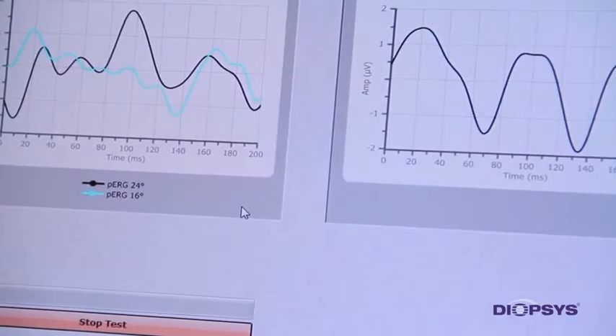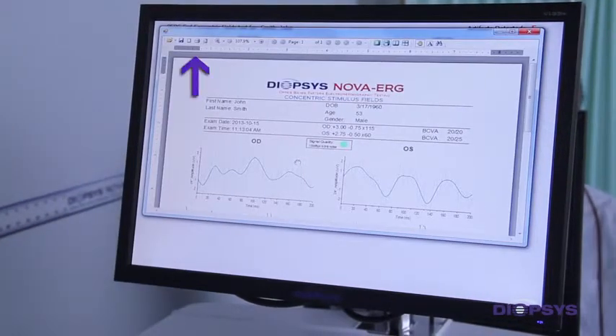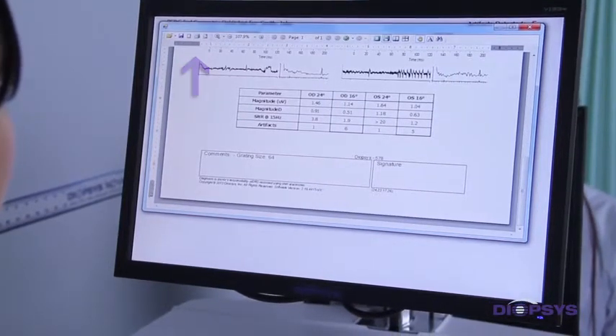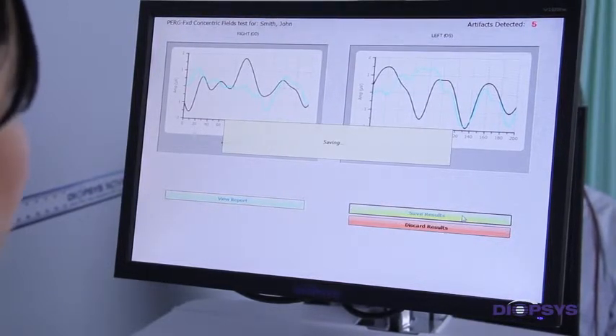Continue to follow the prompts on the screen after each section of the test is completed. Halfway through, the prompts will instruct you to test the other eye. Once all sections are successfully completed, you may choose to print the final report. To exit the report screen, simply click the X located within the upper right-hand corner of the window. Click on Save Results.